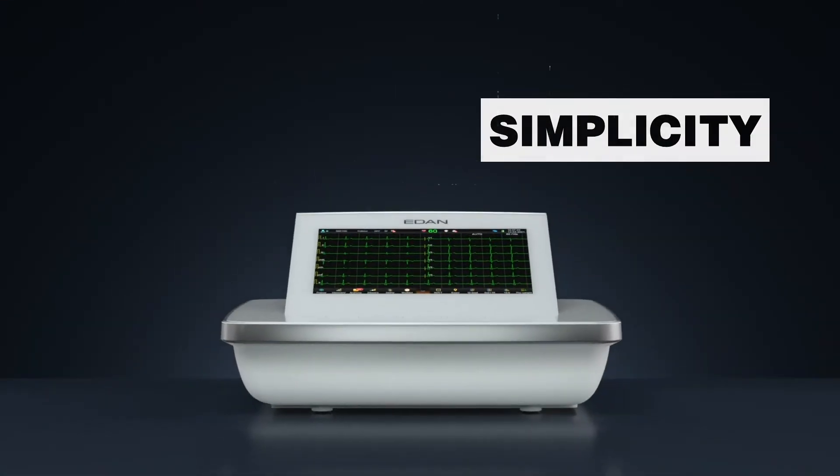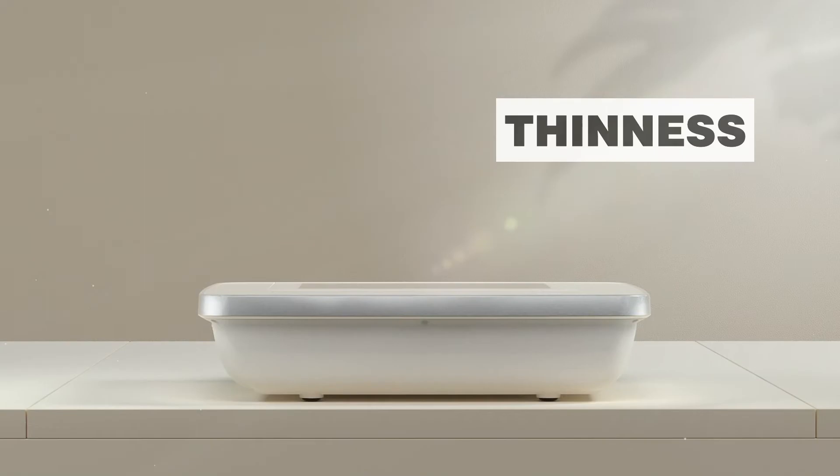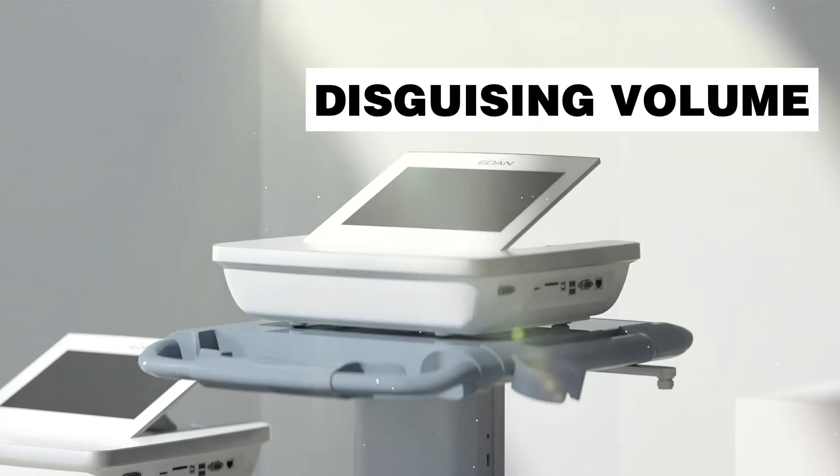I'm Rich Henderson, Chief Corporate Designer for Edan Instruments. The goal of the 1202 was to create a new look and feel centered around our design principles: simplicity, layers, thinness, and disguising volume.